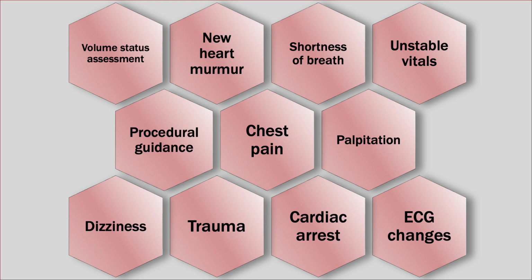There are several indications to performing a point-of-care cardiac ultrasound. Some of the most commonly encountered can be found in this slide to include chest pain and any of its associated symptoms, as well as procedural guidance like in the setting of a pericardiocentesis.